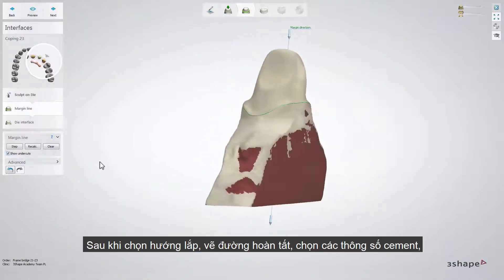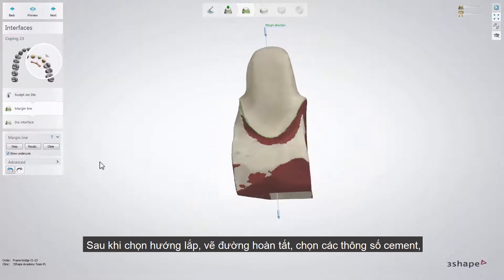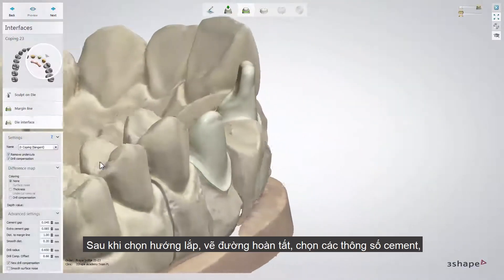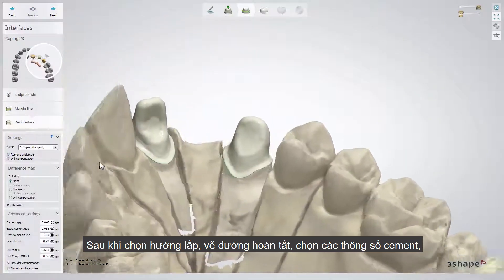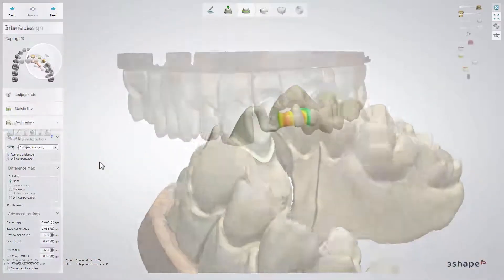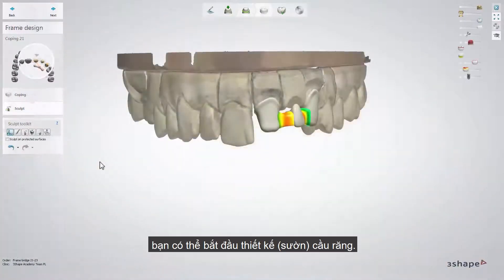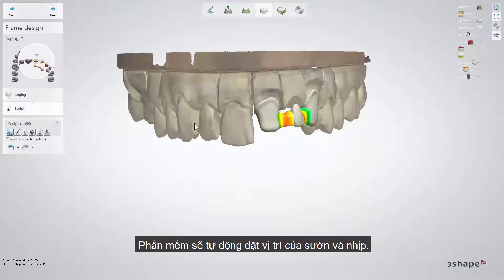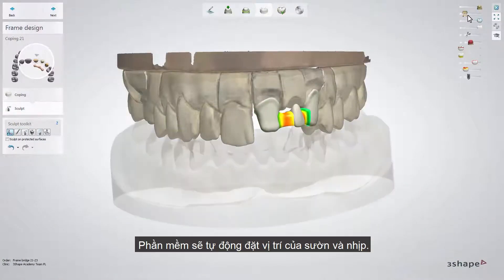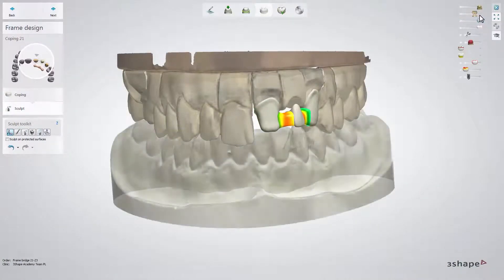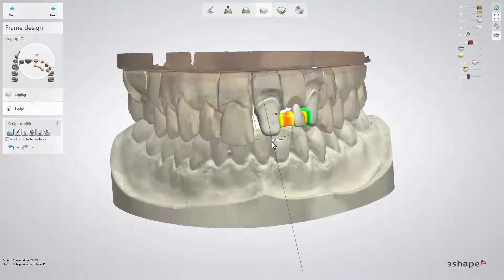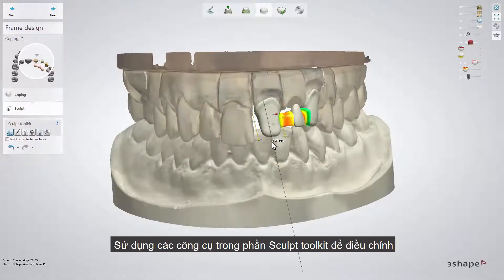Once the insertion direction for the bridge as well as the margin line and the die interface for both teeth are set, you can start designing the bridge framework. The software will automatically place the coppings and the pontic. Now you can adjust the design to your needs using the Sculpt Toolkit.